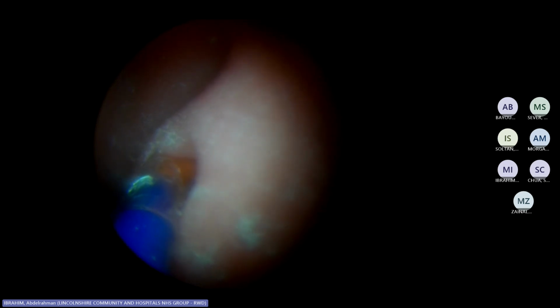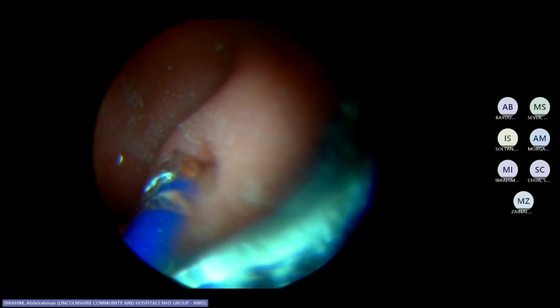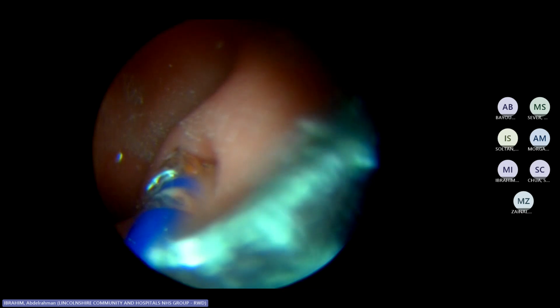Push to the end. It's to the end, but it seems to be leaky? Oh no, you've got the wrong one. No, you've got the right one. You need to fill it in. Is it filled up? Yeah, it should be. But I think the balloon itself is leaking. Through the tubing, because you've used it too many times. Okay. Anyway, that's it.